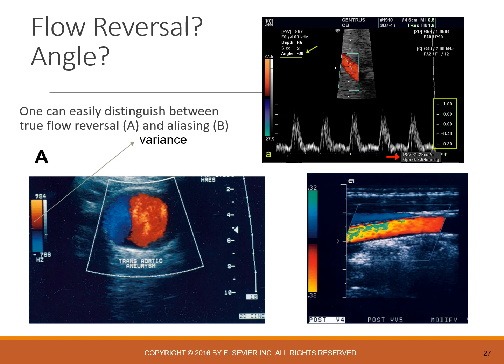In this particular case, this is an aortic aneurysm, so this would show a dilatation of the aorta, which the red is coming down because of the dilatation. There's some turbulence, and it's kind of swirling in here like a dishwasher, and then it's going to turn and go back down. So this is actually a true separation of flow. This would be showing accurate information.